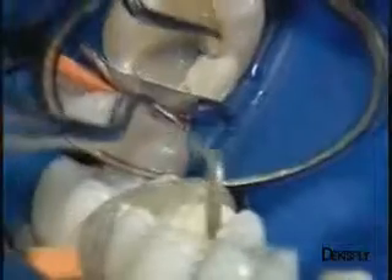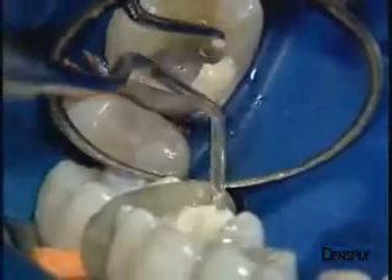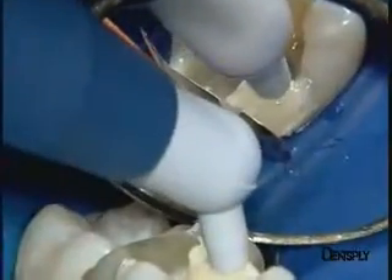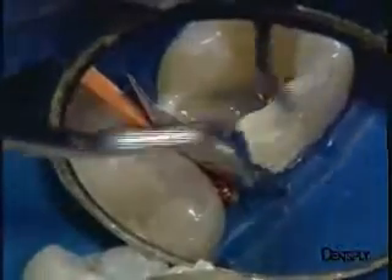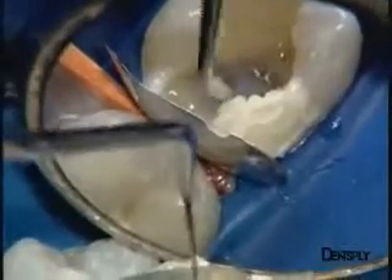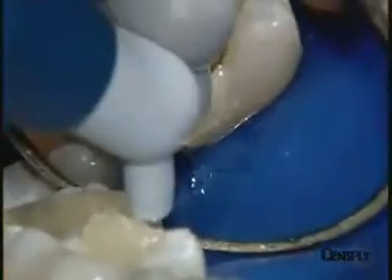We then continue adding material to the wall at the distal lingual cusp. Note that care is taken at this stage not to place any restorative material at the distal proximal contact point. Sufficient resistance needs to be obtained within the composite wall so that a separation system can subsequently be put in place, thus allowing a strong and solid contact point to be established.